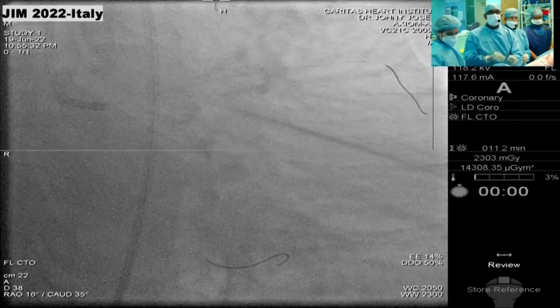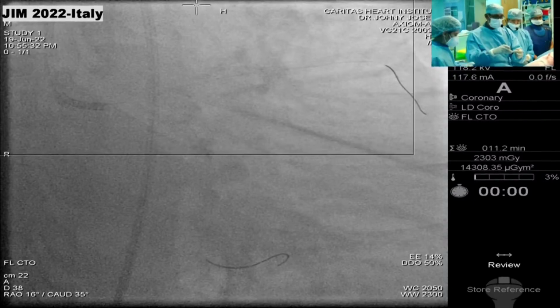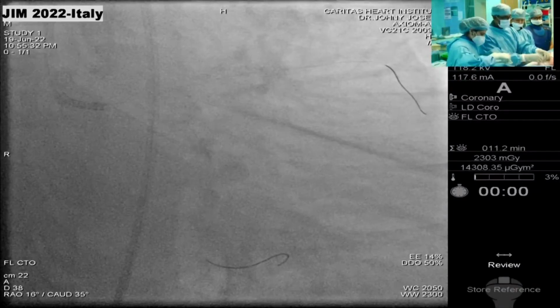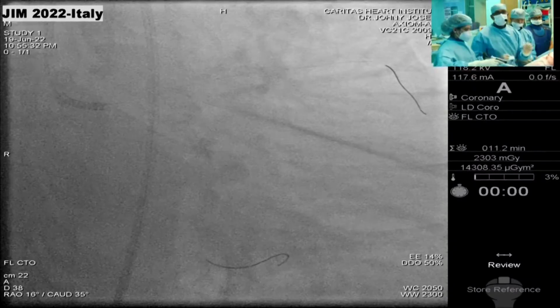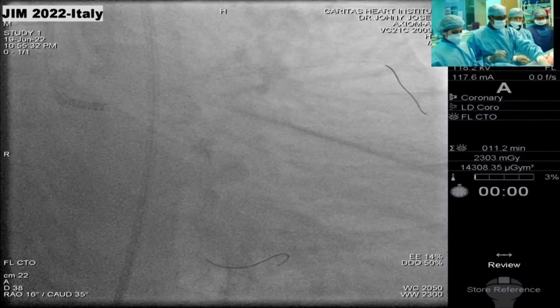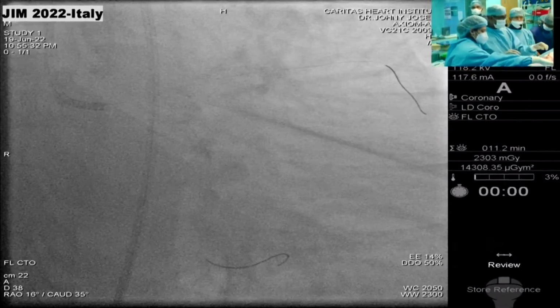Carlo, at least I learned a lot from the OCT. I was suspecting there would be a high degree of calcium at the culprit occlusion, and angiographically, fluoroscopically, it looked severe. I agree with the interpretation of the OCT. I'm just saying I was surprised. I think we learned a lot from the OCT. Otherwise, I would say there's tremendous calcium at that area, which apparently is not that much. Weren't you surprised too? Yes, I am.